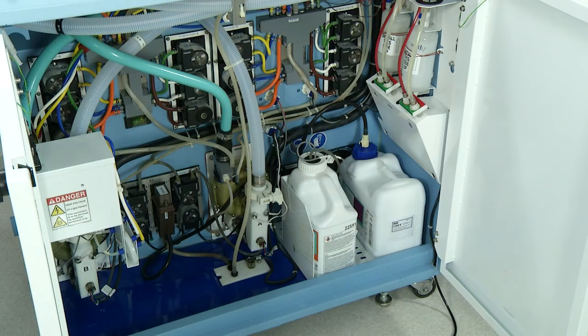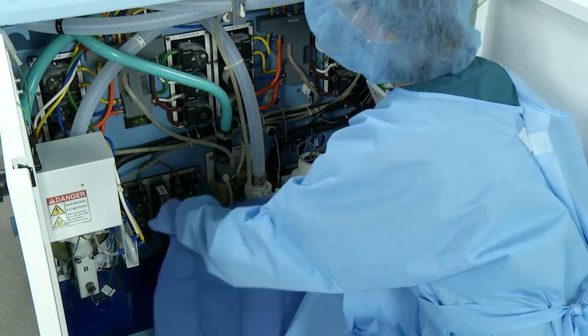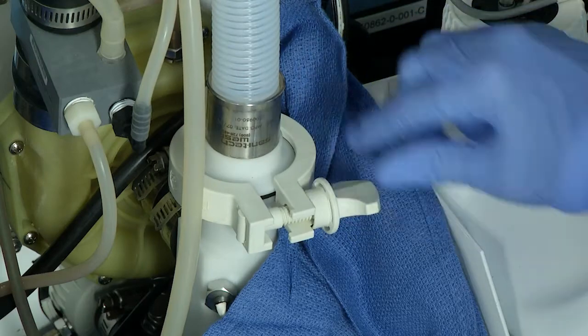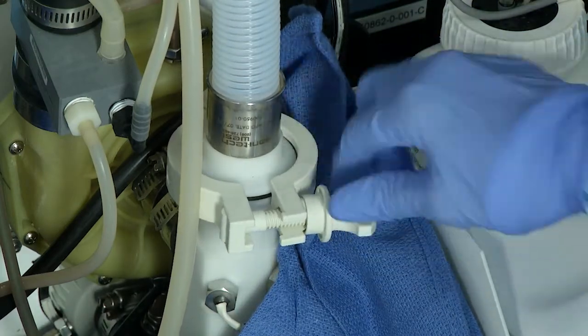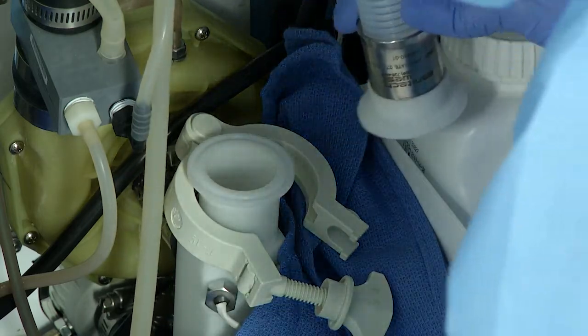If items have fallen into the insertion tube, you need to remove them before running a cycle. The manifold serving the left A basin is located on the right. The manifold serving the right B basin is on the left. Unfasten the clamp and remove it. Remove the O-ring and save these items for later use.